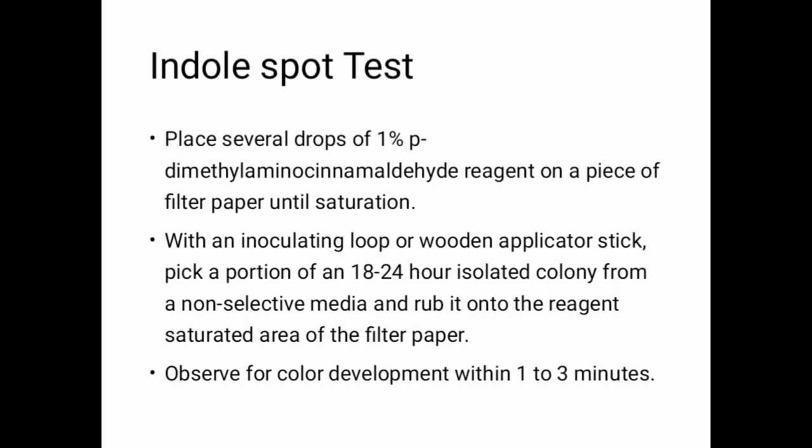So simply, we take the colony from the 18 to 24-hour culture and rub it on filter paper, then observe color development within 1 to 3 minutes.